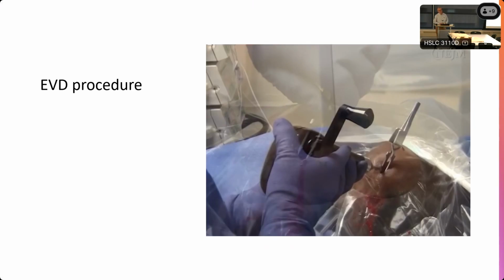It's not a visualization procedure. If the goal of your retractor is to see everything, you're drilling a hole that you're not going to be able to really visualize the bottom of. All it does is make the incision longer and give you a prime opportunity to pull your catheter out of the head when you pull your retractor out. I always just thought it's protecting the skin. I don't think there's a wrong or right answer to this.